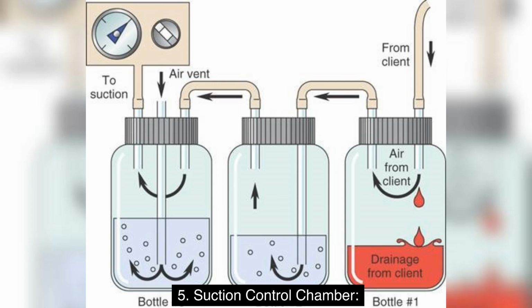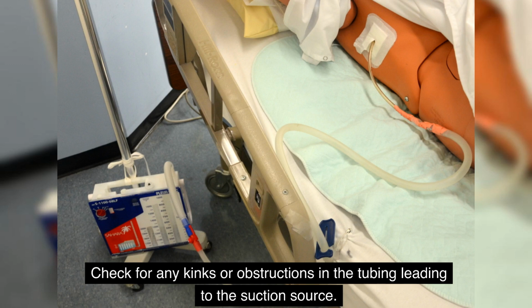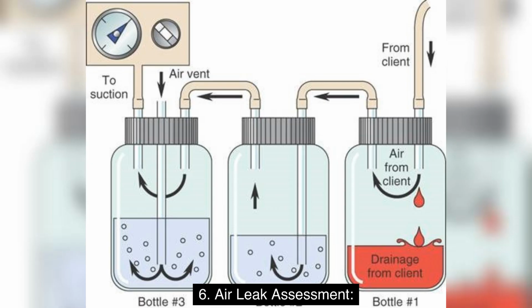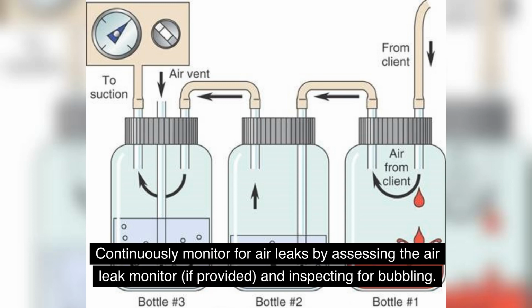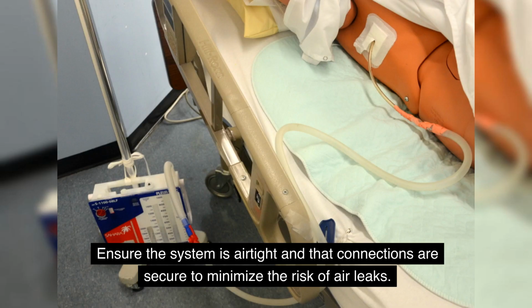5. Suction control chamber. Maintain the prescribed amount of suction in the suction control chamber as ordered by the healthcare provider. Check for any kinks or obstructions in the tubing leading to the suction source. 6. Air leak assessment. Continuously monitor for air leaks by assessing the air leak monitor, if provided, and inspecting for bubbling. Report any changes in the pattern of bubbling. Ensure the system is airtight and that connections are secure to minimize the risk of air leaks.